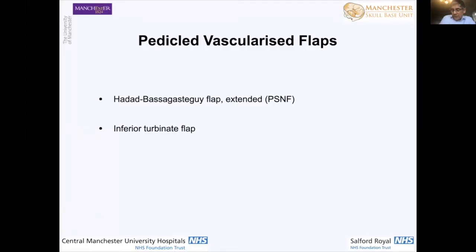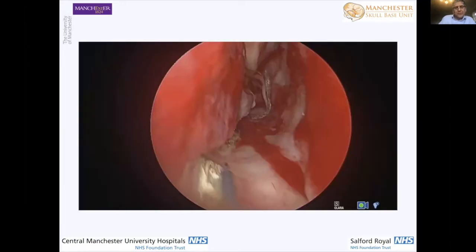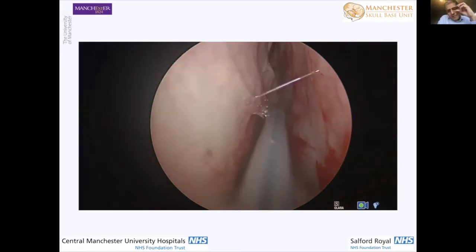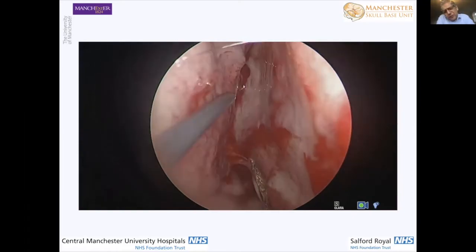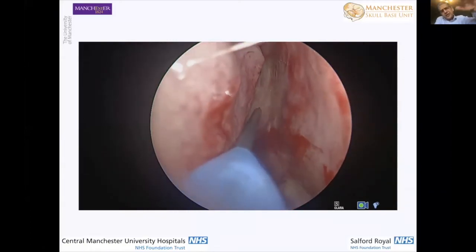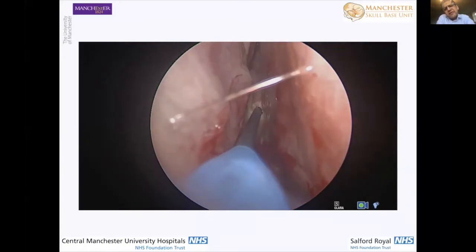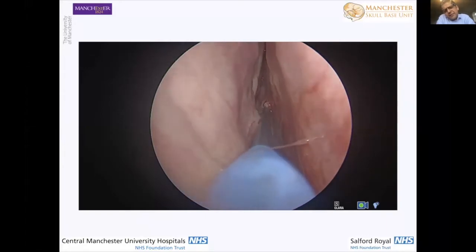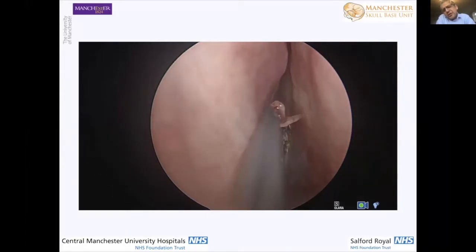Our go-to local autograft flaps for a primary operation, or secondary operation where flaps haven't been compromised previously, are an extended posterior septal nasal flap and an inferior turbinate flap. The extended flap goes down onto the floor of the nose and even underneath the inferior turbinate. I've also harvested all the tissue off a turbinate for larger defects. We use a monopolar cautery to delineate the margins of the flap, just underneath the sphenoidal ostium on the right side.